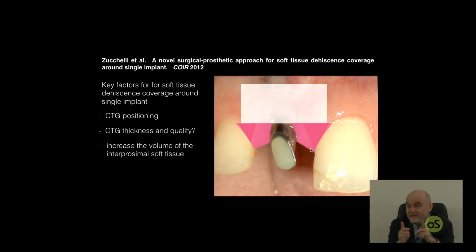That means that this area not only leaves some connective tissue once you remove the epithelium, but you can use this wider area and extend the desepithelialization towards the palatal aspect because of the dimension and the distance between the abutment and two adjacent teeth, and extend the vascular area towards the occlusal and towards the palatal aspect of this papilla, which is not more a papilla, but it's a supracrestal soft tissue.